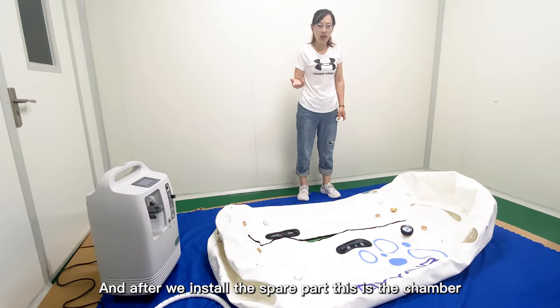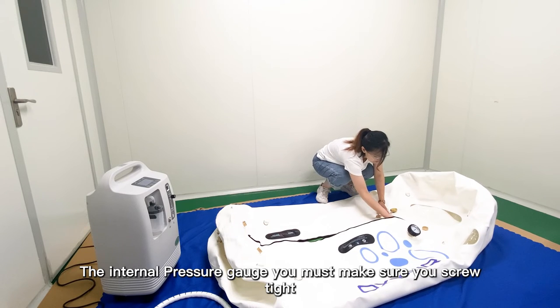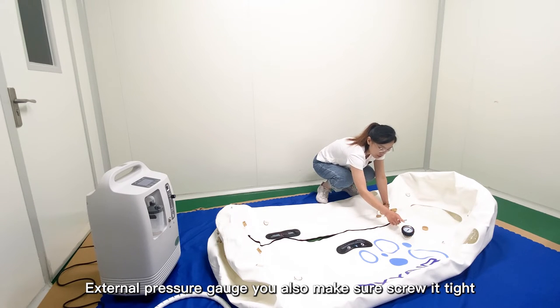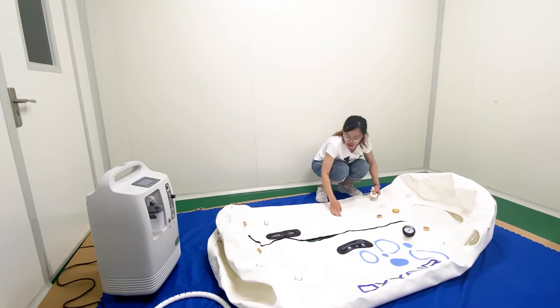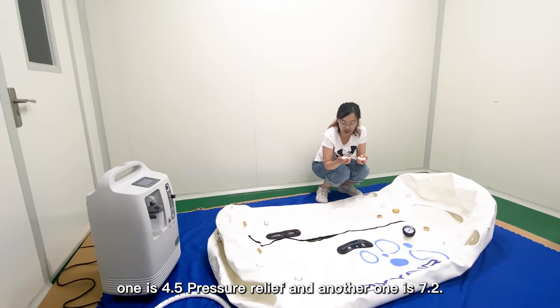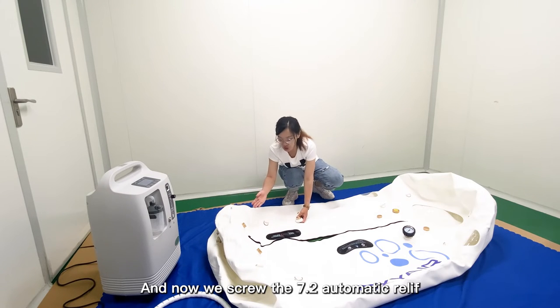After installing the spare parts, before you input air to the chamber, you must make sure every part is screwed tight — the internal pressure gauge, the external pressure gauge, and the automatic pressure relief valve. We provide two automatic relief valves: one is 4.5 PSI and another is 7.2 PSI. Choose the suitable one for your requirement. We will now screw in the 7.2 automatic relief valve.